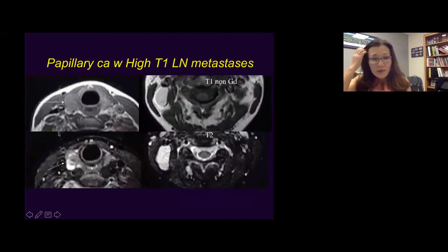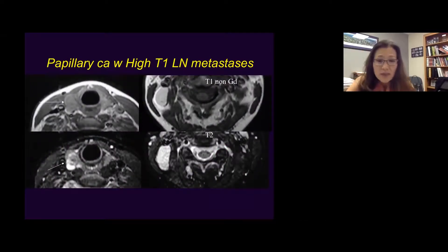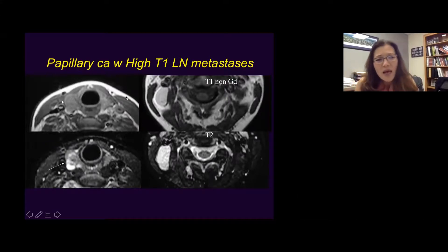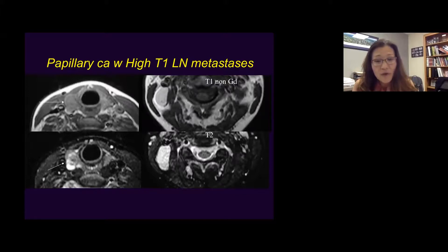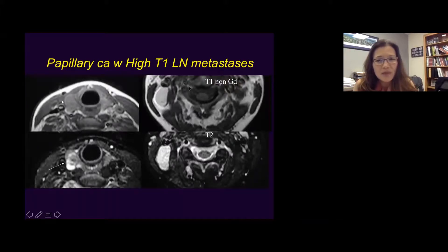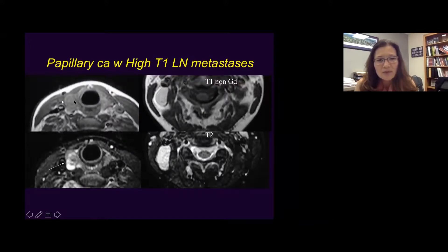One important note about papillary thyroid cancer — they tend to have a high T1 signal without contrast on MRI. So when you see hyperintense nodal masses on non-contrast T1-weighted images, you need to look for thyroid cancer, because you often find masses in the thyroid gland. This is a great example: T1 hyperintense nodal masses — without contrast — and T2 bright nodal masses coming from papillary thyroid cancer metastasis.